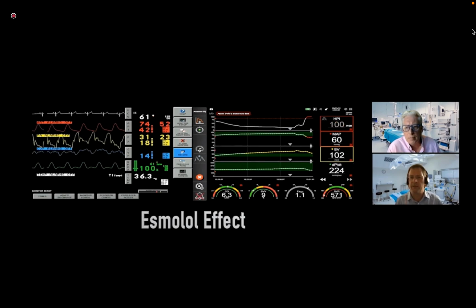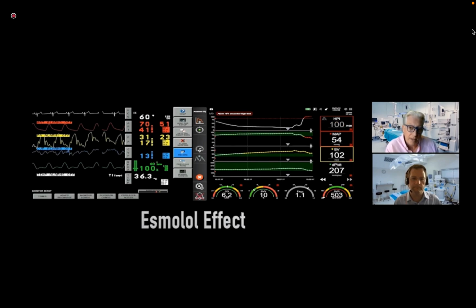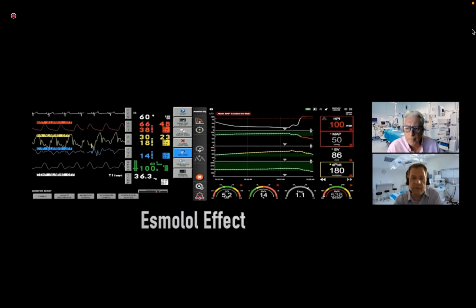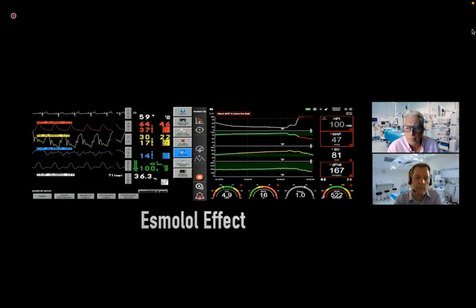Stroke volume starts to decrease, and more importantly, that decrease in contractility is being reflected by a decrease in our DP/DT. So this, you're saying, is less to emphasize the HPI effect because we gave the beta blocker here. It's a very artificial scenario, but a pretty clear reduction in DP/DT there. So absolutely, this is not looking at the predictive effects of HPI because it can't predict an external intervention such as this. Really focusing on, does DP/DT represent what's going on in terms of our left ventricular contractility?